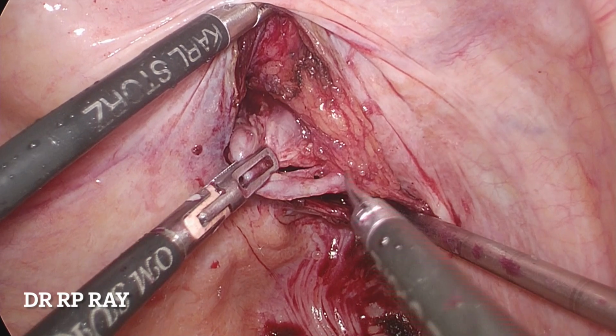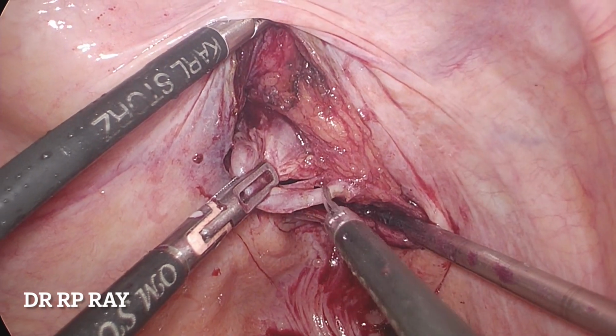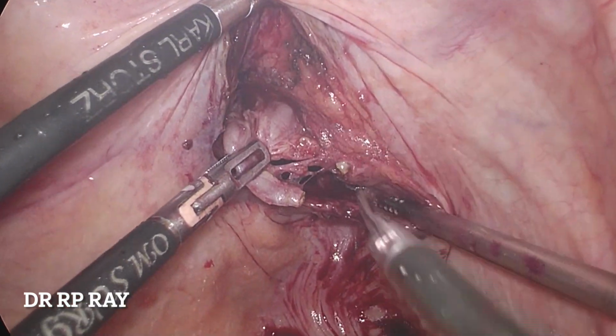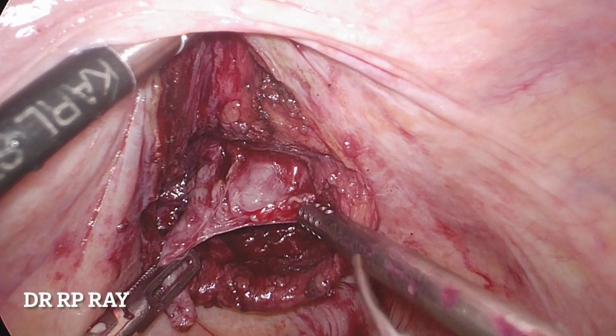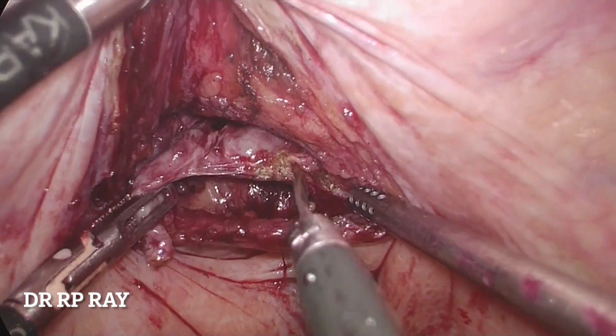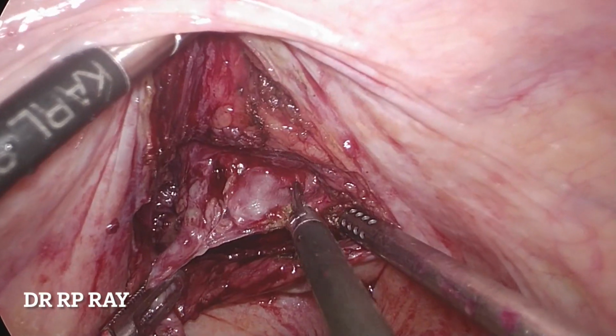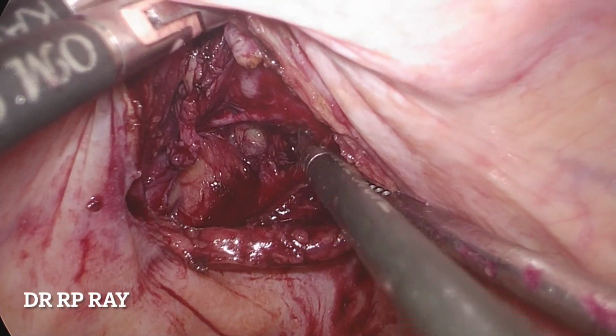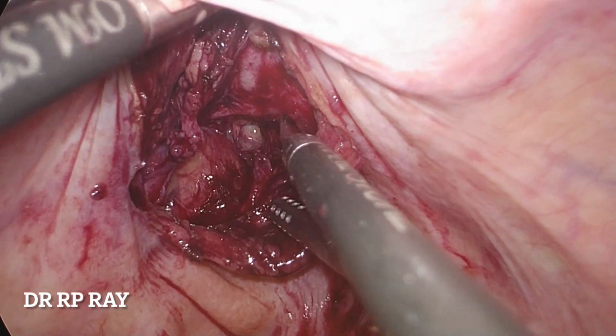The right vas is cut, and then the remaining portion of the seminal vesicle is freed from the surrounding fibrofatty tissue. Here the small vascular supply to the seminal vesicles you may encounter, and that is cauterized with either clip or by bipolar forceps.